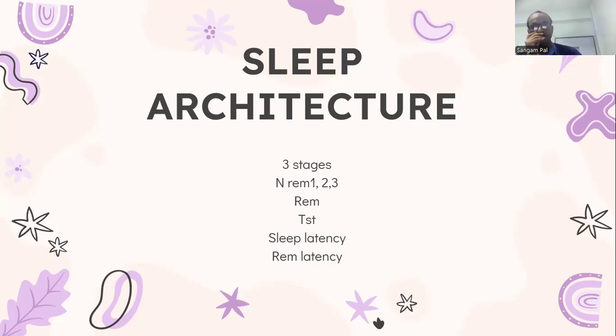If the REM percentage is low, that means the study has underestimated apnea or hypopnea, because if the patient had achieved the same amount of REM sleep, there would have been more apneas and hypopneas in REM, as muscles are almost paralyzed.